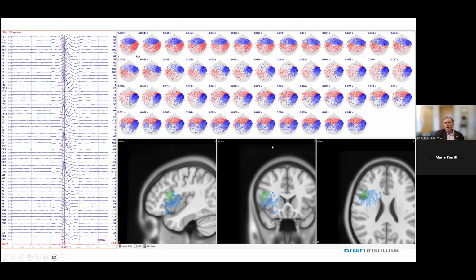So something that I haven't really talked about is I've been modeling all of these as single dipoles, but maybe these ones aren't best modeled. Maybe there's some concern that we need to be separating out from the single model to more than one dipole or to using spatiotemporal models. Ultimately, I didn't go that far. I thought that this would sort of illustrate the point that there's a lot of ways that we can be utilizing to understand these patients' data, and that utilizing some of these things is going to help us move forward with what we're going to try and propose when we have a patient in front of us who's having a hard time with their epilepsy.